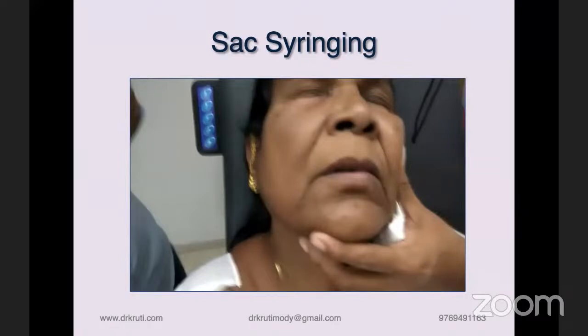You will see what happens. Sometimes in a lot of places we take a small needle, we remove the sharp end and we use it as a blunt tip. You don't go deep enough, okay? If there's common canalicular stenosis, not a complete obstruction, you will still get a regurgitation, okay? And you will not know where it is coming from.